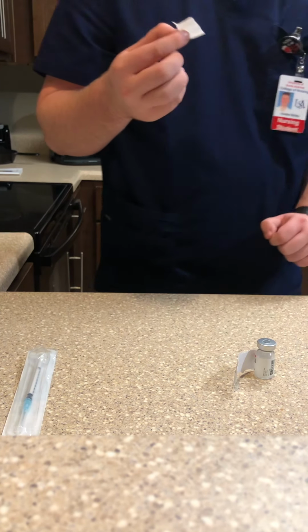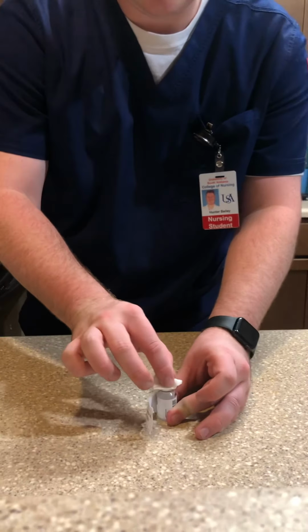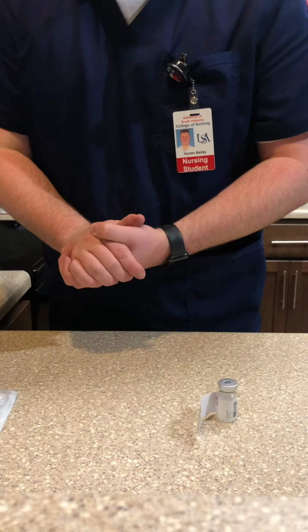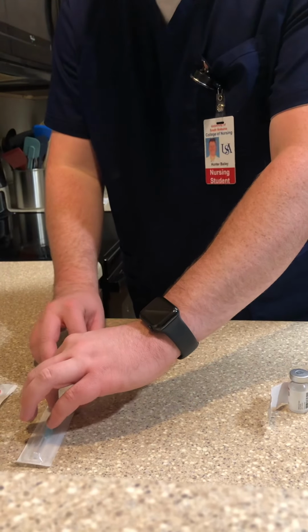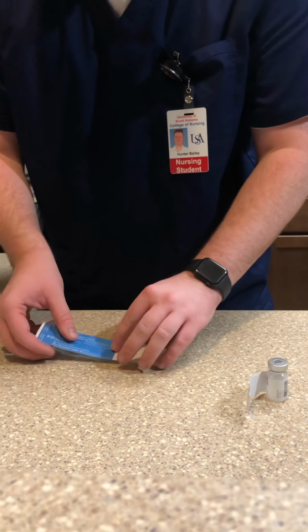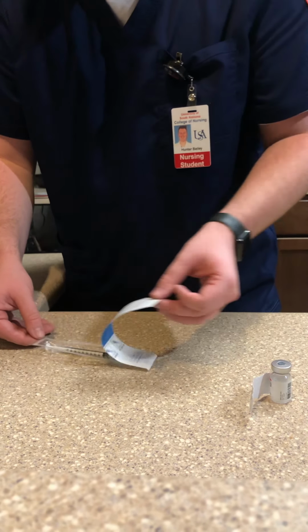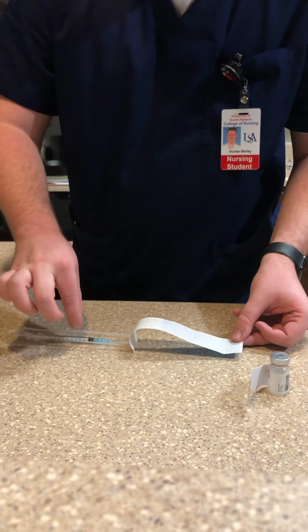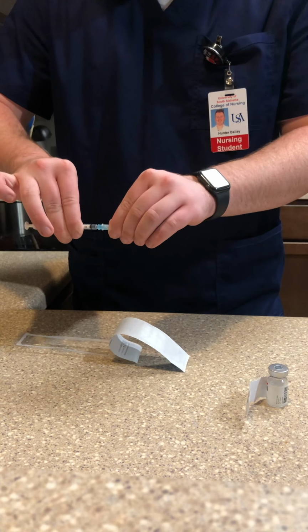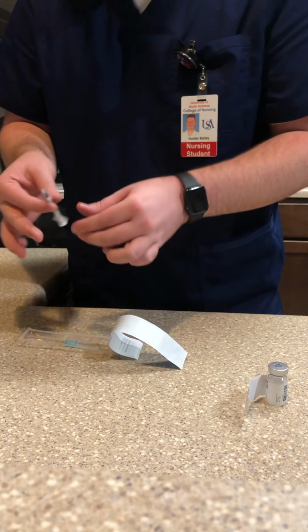Okay, I get my alcohol pad and cleanse the top of the vial in a circular motion and dispose of this in the trash below me. Now I'm going to get my TB syringe. I'm going to open the syringe, and by maintaining sterility, I'm going to grasp it and remove the needle. I'm going to place it back in the package.